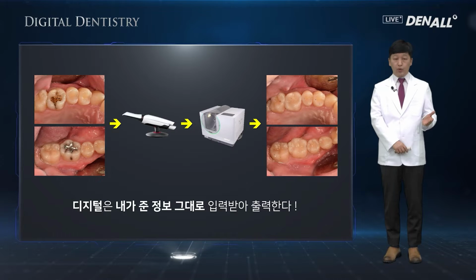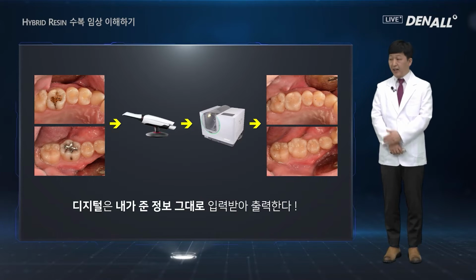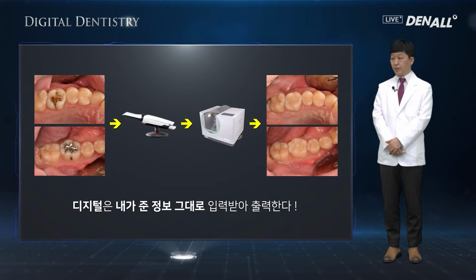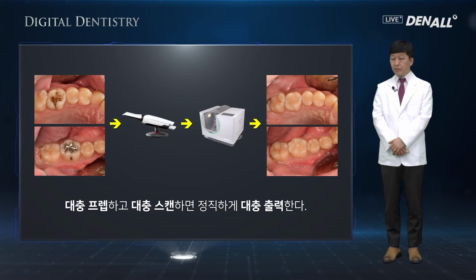If prep is insufficient, lab technician can block that out and can adjust it and make a perfect restoration. However, in the case of digital dentistry, it provides restoration based on the information that I provide. If prep is not good, then bad restorations will result. No one will correct my mistakes. Therefore, prep is very important.